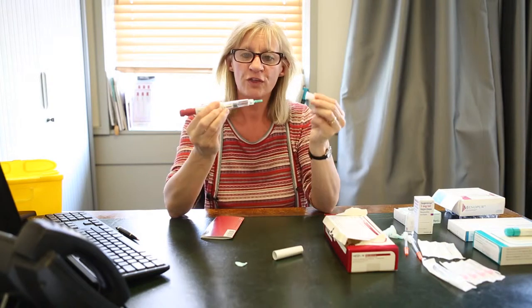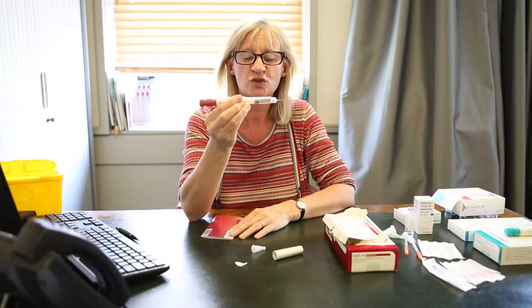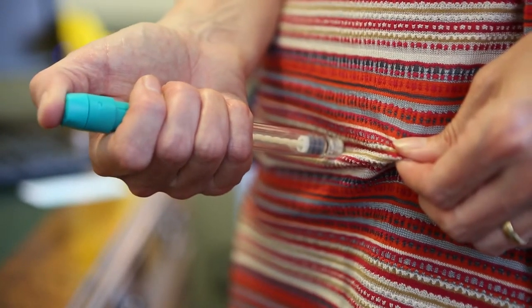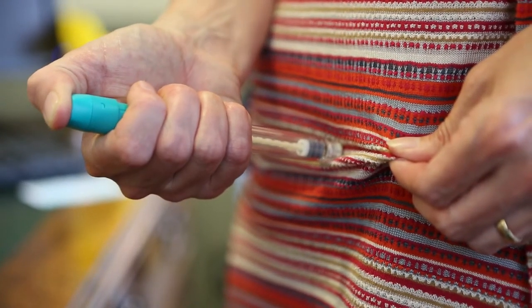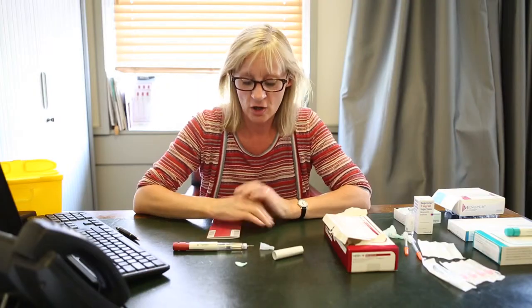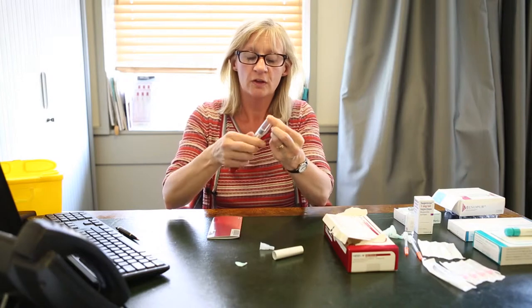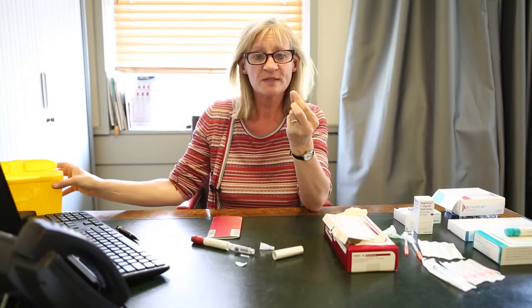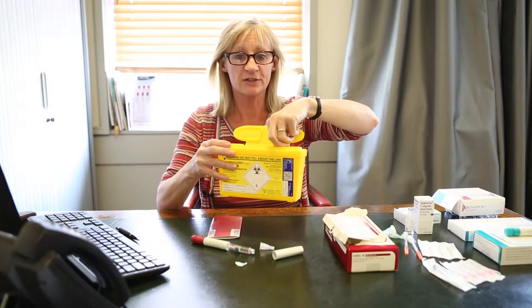You then take off the outer cap, and you'll see there's a small green cap — you need to take this off as well. Then again, you're going to inject this either into the abdomen or you can inject it into the thigh. Once you have injected the drug, remove the needle by twisting it, and you'll be provided with your sharps bin where you can place the needle.